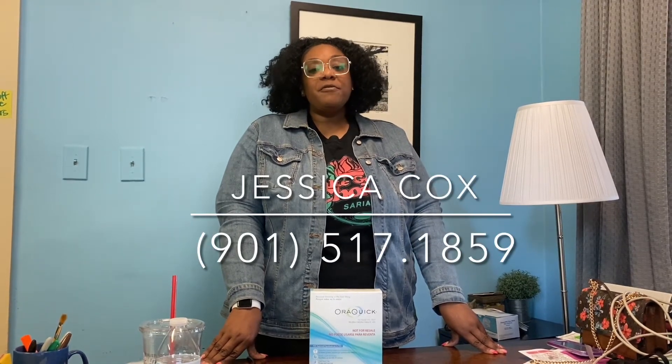Welcome to the Hope House video for the OraQuick In-Home HIV Testing Kit. When it comes to HIV, knowing your status is really important. So by taking this HIV test, you're doing the right thing. With the OraQuick In-Home HIV Test Kit, you can know your status in just 20 minutes. The results are completely confidential, and if you have any questions at any point during the test, you can call our Hope House Social Worker, Jessica Cox, to be linked to a test administrator via phone or Zoom. Taking an HIV test can be a little stressful, but don't worry — I'll be taking you step by step through the test.